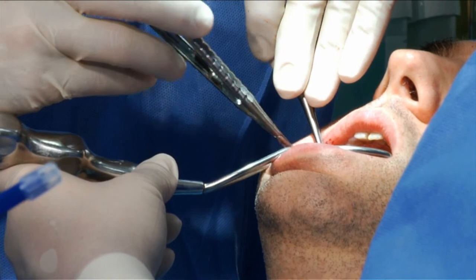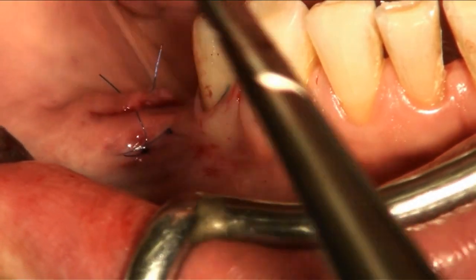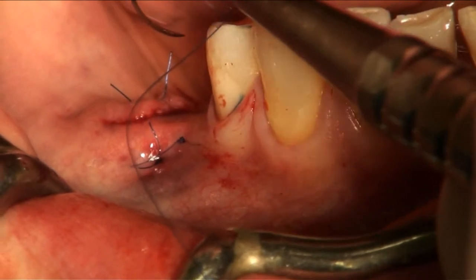Now we have placed the mattress sutures for taking tension off the flaps, and the remaining incision is closed with simple single interrupted sutures.